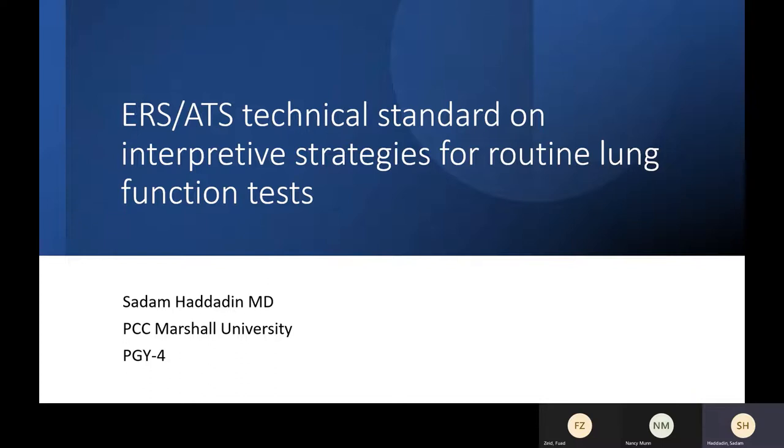How do you differentiate, coming from, let's say, asthma, especially that we're talking here about obstruction, when we're talking about remodeling? This is like the extreme thinking, because let's say an asthma patient, at one point or another, ends up with remodeling. If it's not reversible anymore, and the FEV1 is less than the lower limit of normal during the normal status, like not during an attack, that's remodeling. Yes. That's so right. Sorry, Saddam. No, that's fine. Sure.